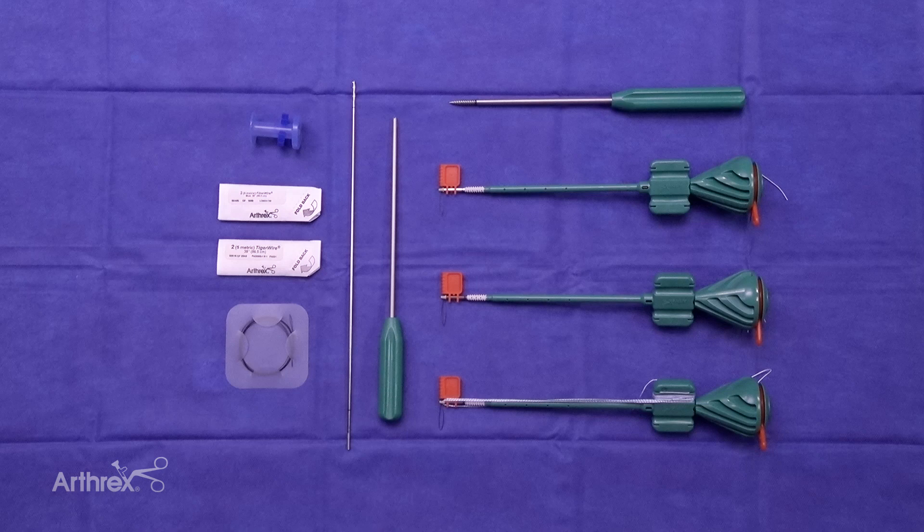Today we will be reviewing the new ACL Swivel Lock Repair Implant System. The kit contains three 4.75 biocomposite swivel locks.